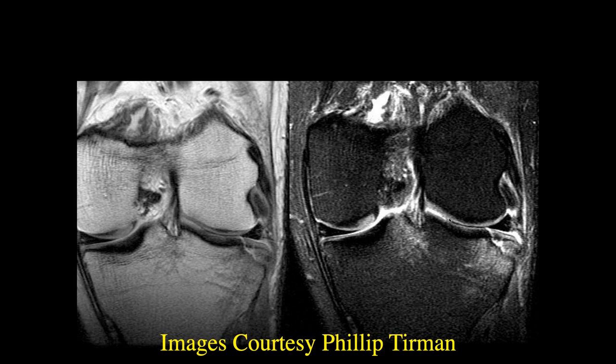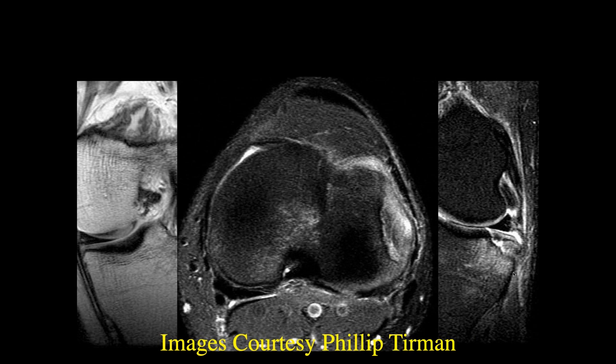Jennifer, what do you think of this case? So there's linear increased signal intensity along the tibial plateau, extending from the articular surface to the margin with surrounding edema, compatible with a non-displaced fracture, and it does extend through the articular surface. Yeah, well, it's certainly impacted, and there's probably a little bit of displacement here. This was a ski injury.